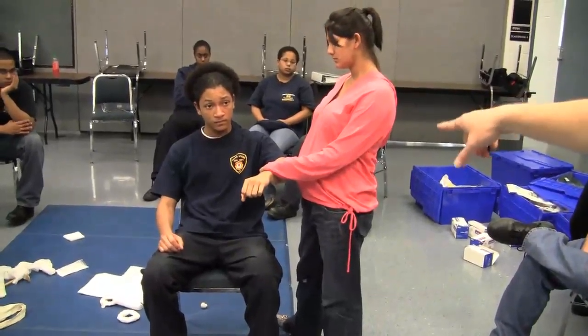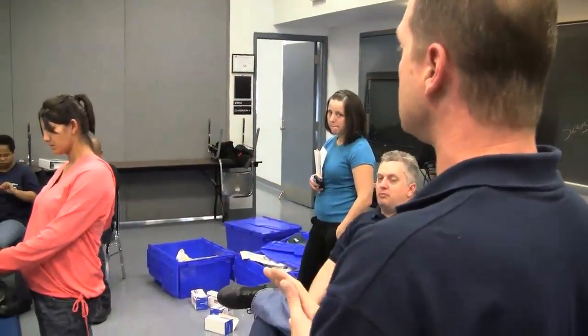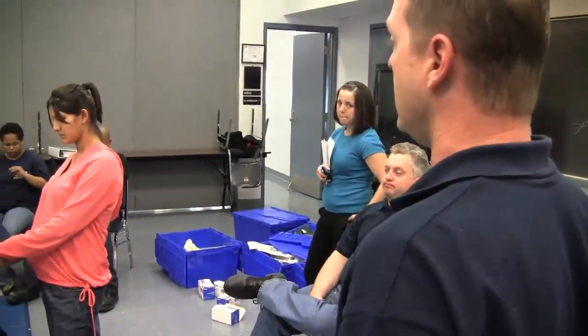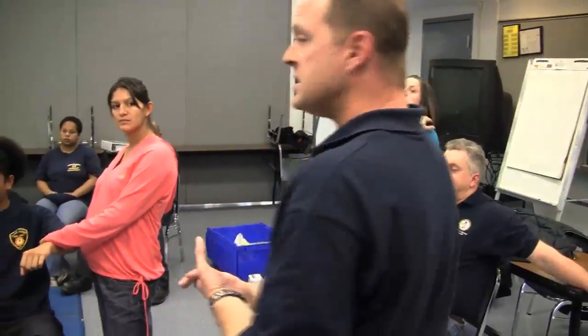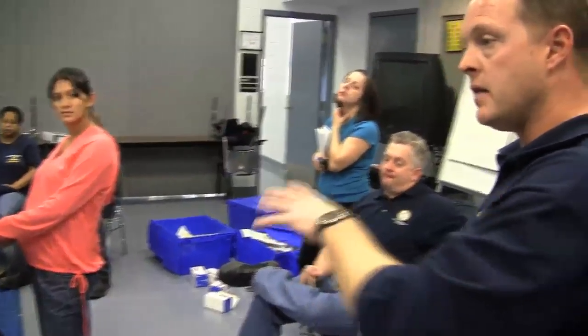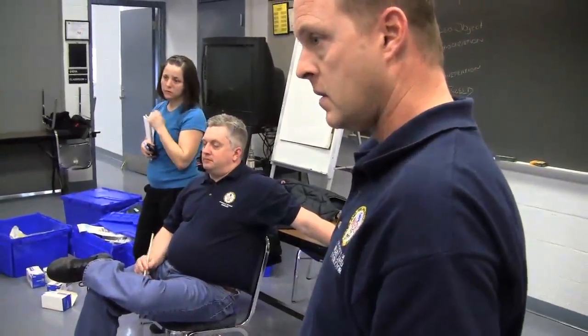If she's unable to control that bleeding with just direct pressure and a dressing, we're going to go with the tourniquet. If the arm is injured or what have you, if your initial methods of bleeding control are unsuccessful, it's a tourniquet.